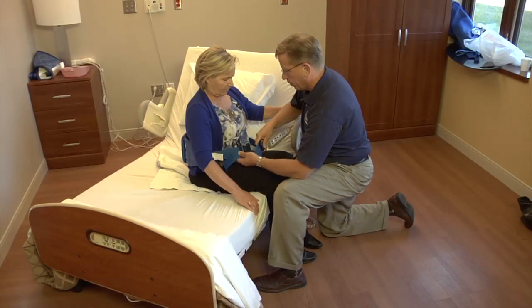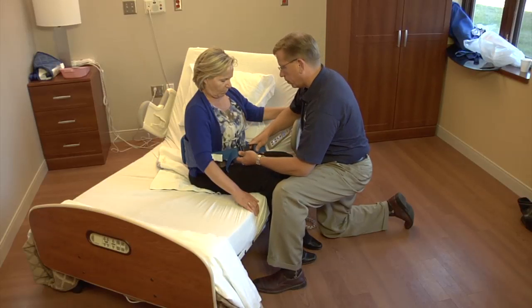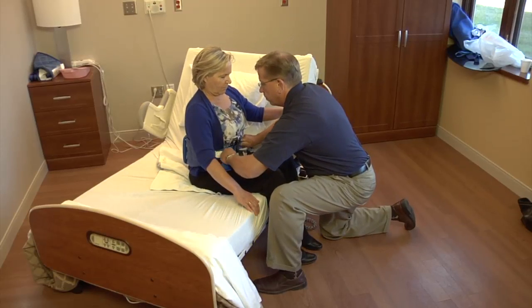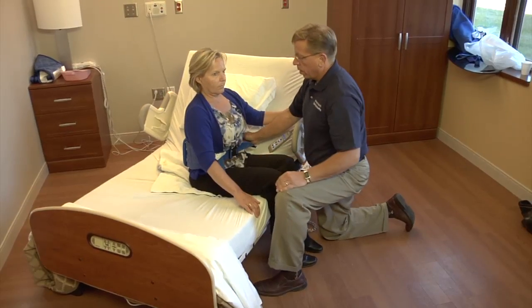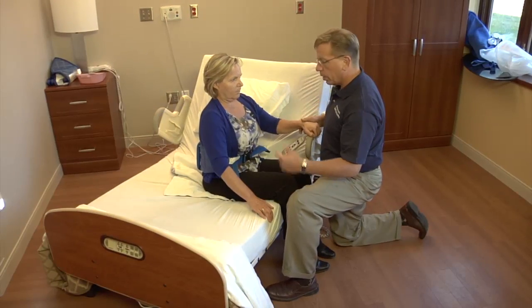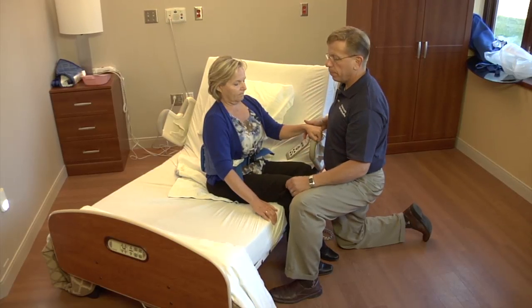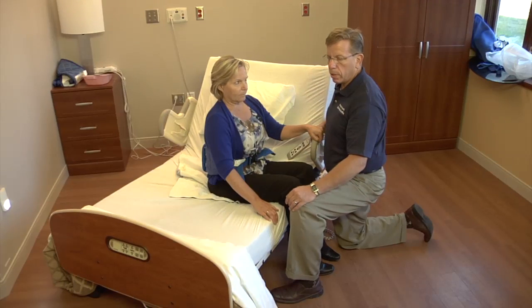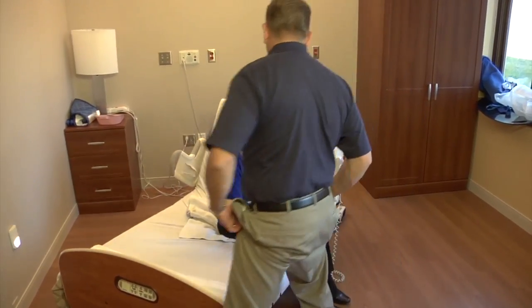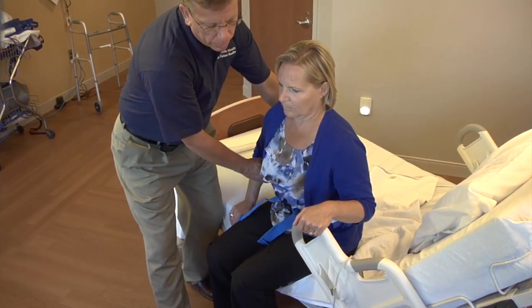As you're assessing your patient for readiness to stand and bear weight, you need to remember that they should be using a device. They're either going to use a walker, a cane, or the side rail to help them stand. You do not want to pull them up to their feet. Caregivers positioning themselves with good body mechanics, close to the patient as possible, cueing that patient to stand by pushing up. You notice that the patient was not lifted by the gait belt.